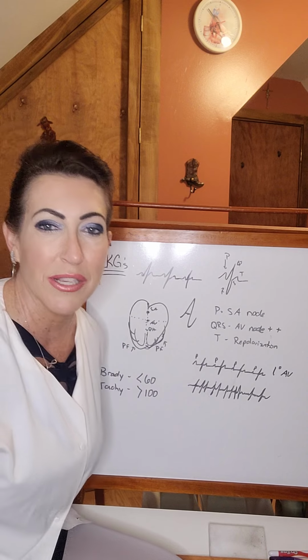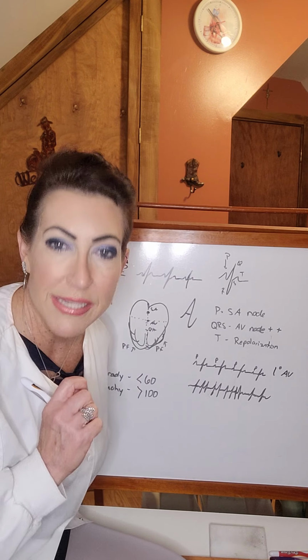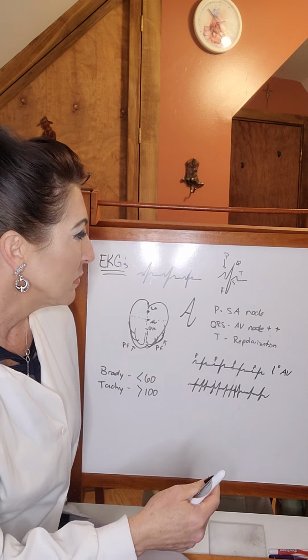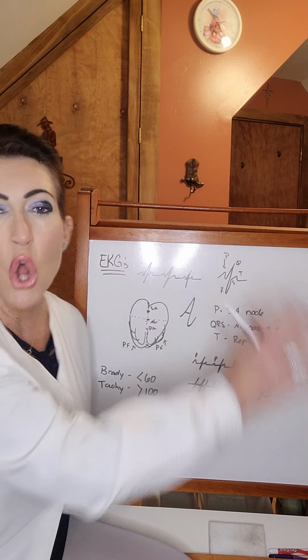She locks the bed, looks up at me and says, he's in complete heart block. I'm like, I'm sorry, come again now? He's in who to the what now? He's in complete heart block, which means there's like a P wave, a QRS, a QRS, then a P. There's no rhyme or reason.